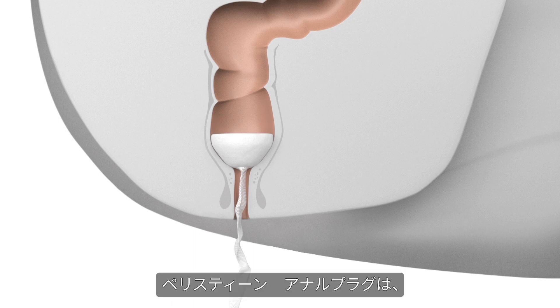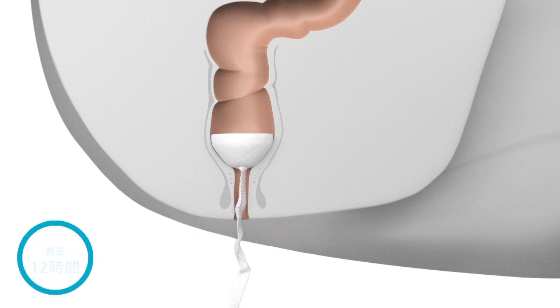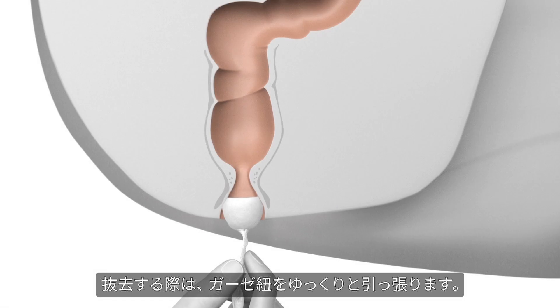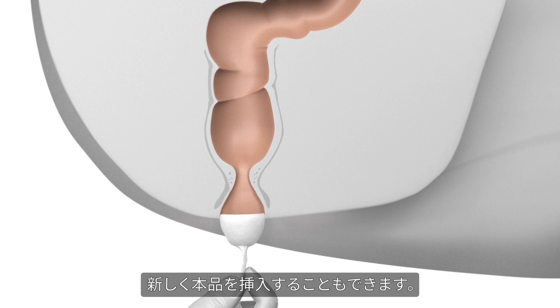Peristeen anal plug must be removed no later than 12 hours after insertion. It is removed by gently pulling the gauze. A fresh plug can be inserted immediately after removal of the old one if required.